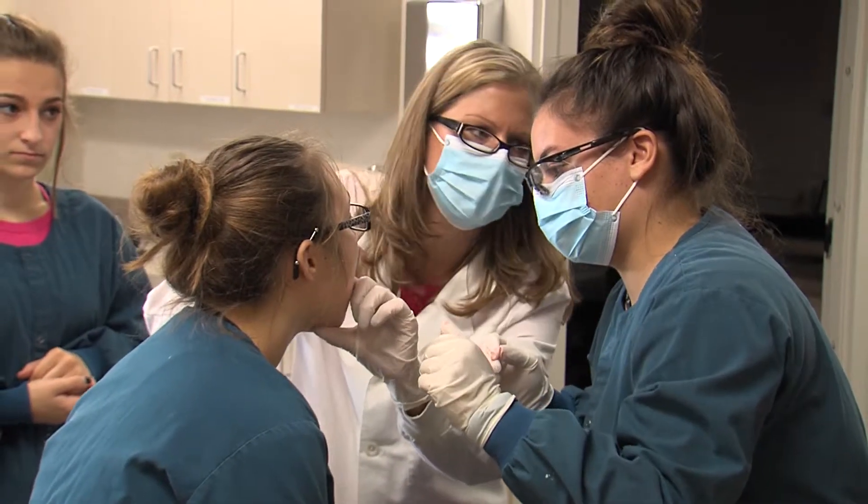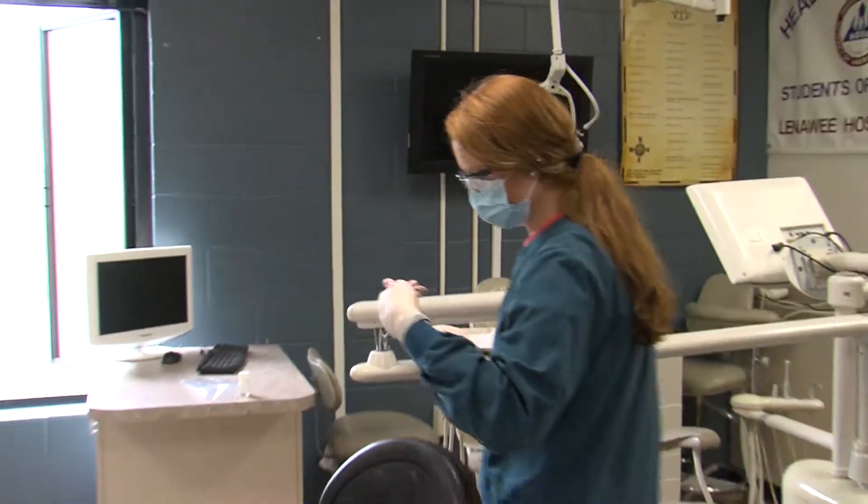Why are we learning about impressions and how to do them? As a dental assistant you're going to take impressions on patients on a daily basis, so you're going to need to know how to do that.